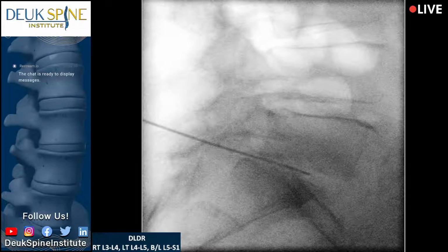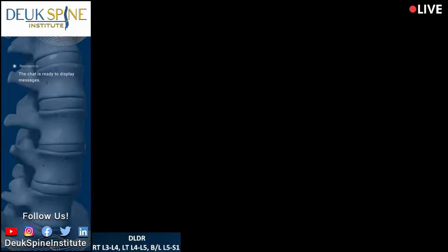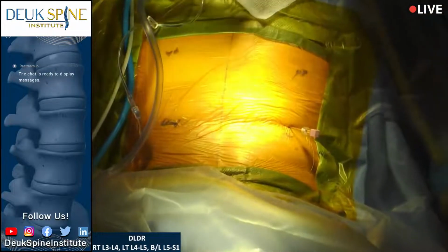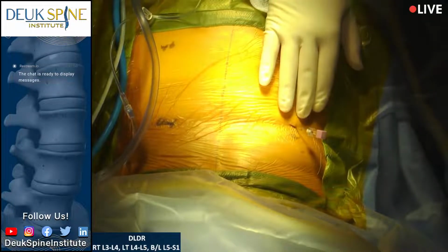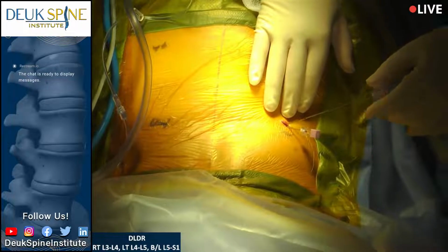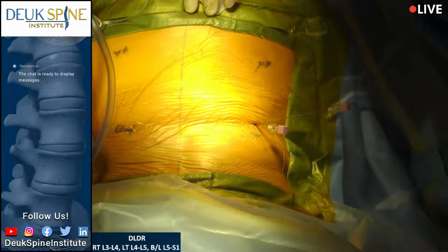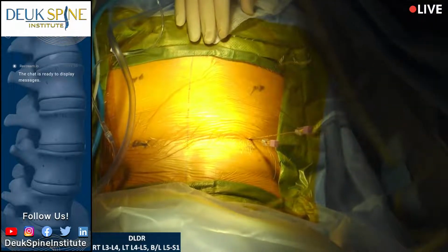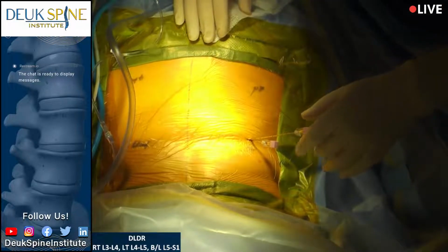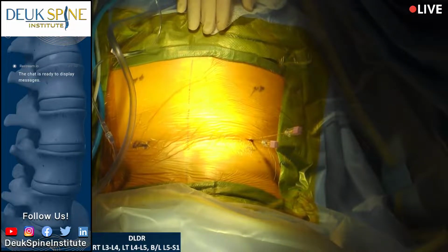And we've had the patient awake and telling us that she has a little discomfort in her back, which is good. I want to make sure I don't get too close to any of the nerve roots, because the nerve roots are going to be just above and medial, just above where I'm working and even lateral. All right, so this left side is 4-5-5-1, guys. 4-5-5-1. We're all in agreement. Shot. I just want to make sure. That's bothering her back? All right.